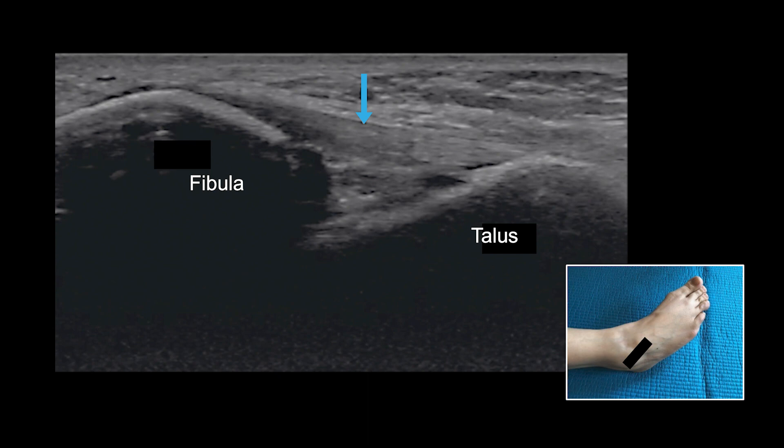This longitudinal image shows a normal anterior talofibular ligament between the fibula and talus. Once identified, the ligament is inspected for integrity, focal defects, and abnormal signals in or around the ligament. The attachment sites are inspected for bony defects that would indicate avulsion-type injuries. These findings help with the grading of ligamentous injuries.